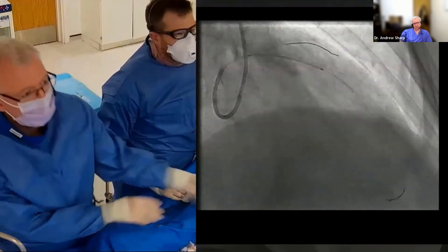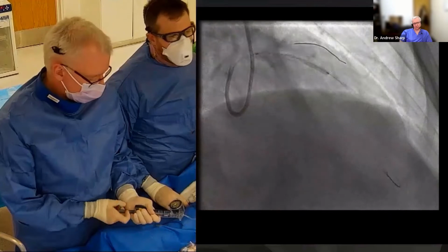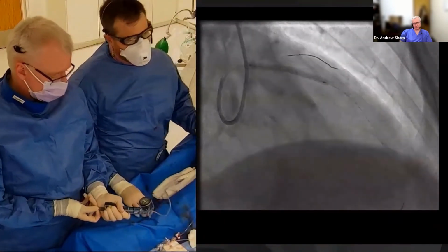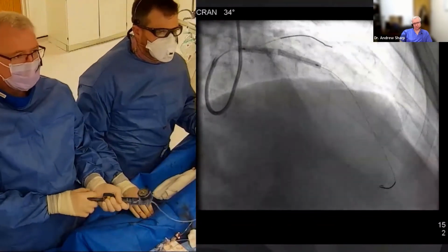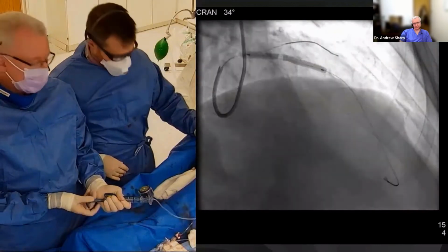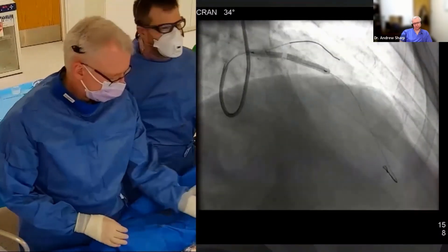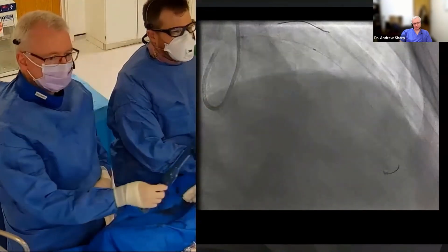So, okay, I'm happy there. Yep, so we're going to go up. Going up, and this is a 3, so we can afford to inflate. I would give it, so I could sort of go 18. 18, yep. So obviously with these semi-compliant stent balloons, they elongate if we go too high, but that's good. You can actually see where it is there. That's 18. Can we have a 3.25/20 NC, 3.5/15 NC, and then a 4.0?